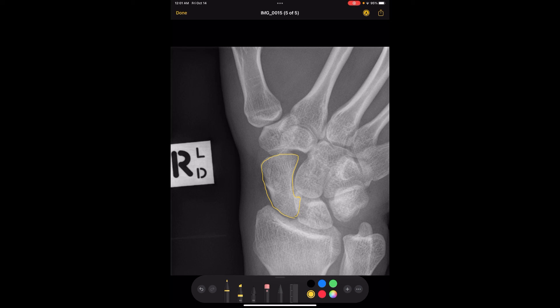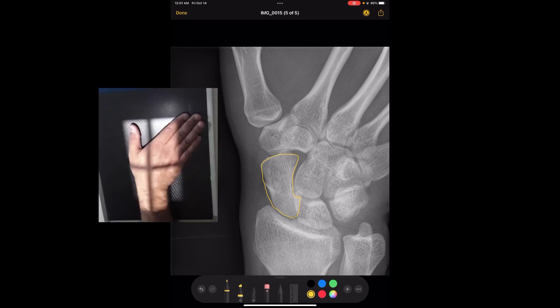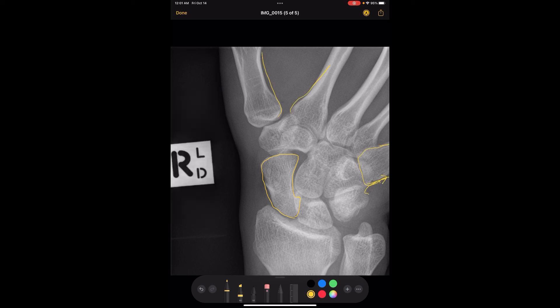To perform the scaphoid view, you'll need to do ulnar deviation — you put your hand, instead of totally flat on the IR, and deviate it over towards the pinky side. Then you angle the tube 10 to 15 degrees towards the elbow, instead of being perpendicular. You also need to make sure that you are centering in the snuff box area, near the base of the thumb. And that's the last view of a wrist.